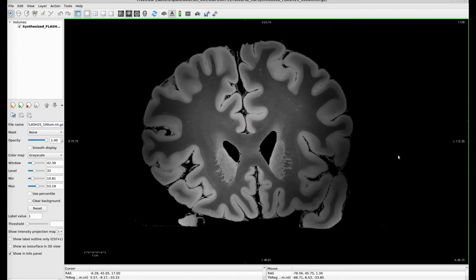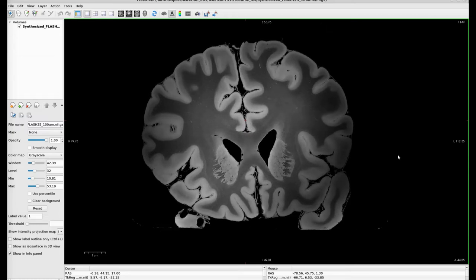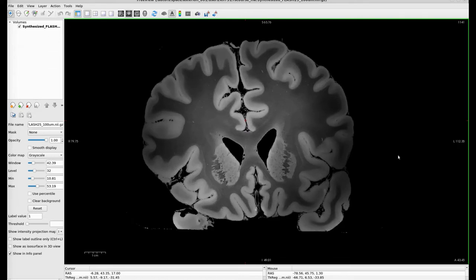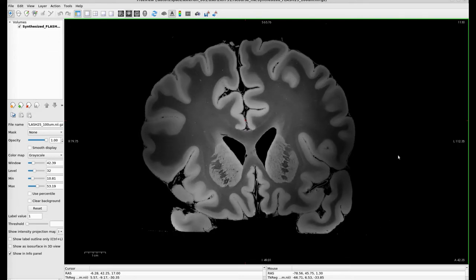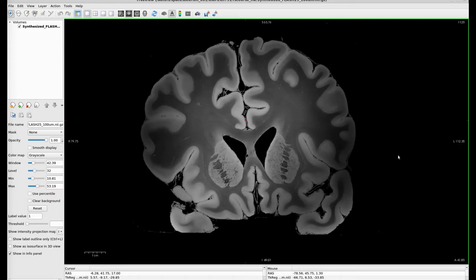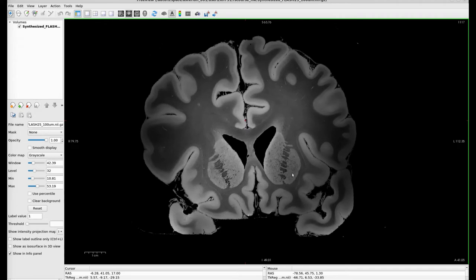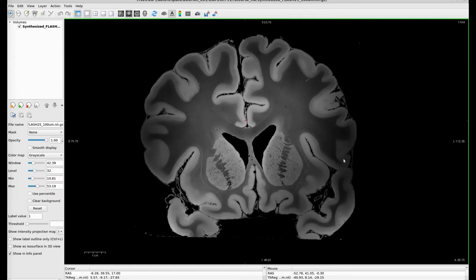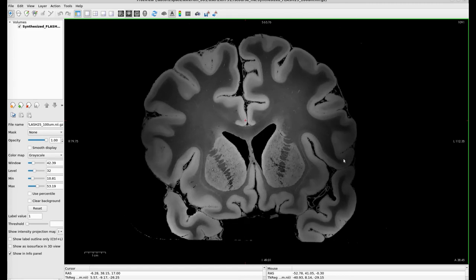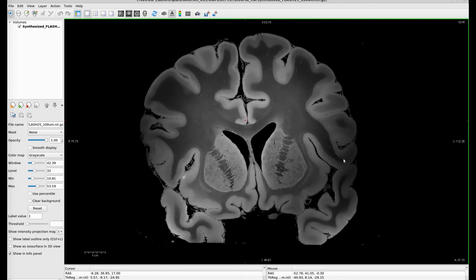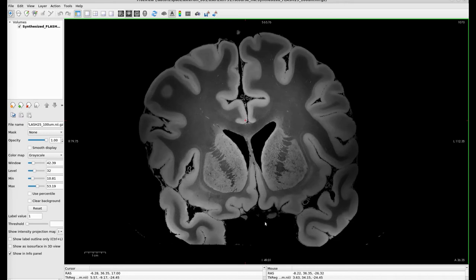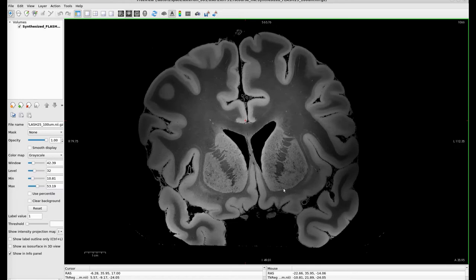As we scroll along here, we can see the caudate is getting a little bigger and we can see the putamen is starting to show as well, moving in the posterior direction. So this is the putamen coming into view, the caudate's getting a little bit bigger. Now as the striatum fully develops here, we start to see the nucleus accumbens right here, and now I'm going to keep scrolling in the posterior direction.